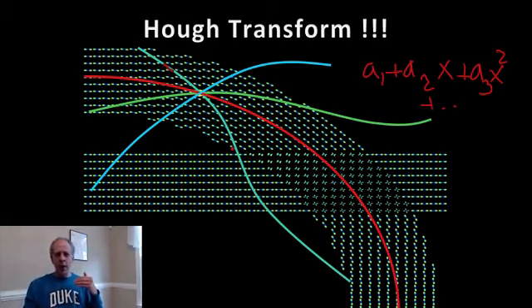When we talked about the Hough transform, we were kind of adding the edge content. If there is an edge, we were voting for it. If there wasn't, we weren't voting for it. Here we actually do a weighted voting. We vote by the probability of going in that direction. But it's the Hough transform. This, I think, is very beautiful, that we can use a very standard theory for a very cool application in a modern image acquisition technology.